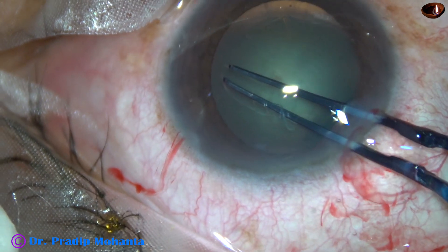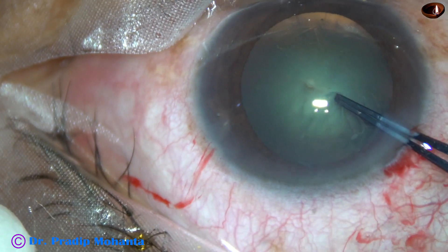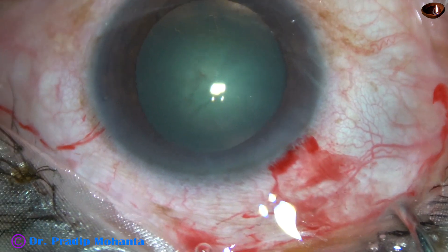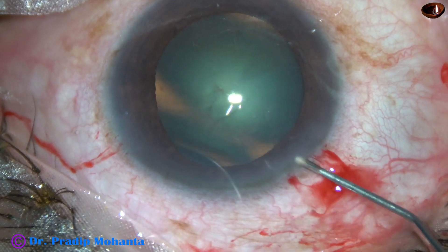Rhexis is being done with the help of Utrata forceps. There was no problem at all — I could see the anterior capsule very clearly. Rhexis is done, an adequate size of about 5.5 mm.